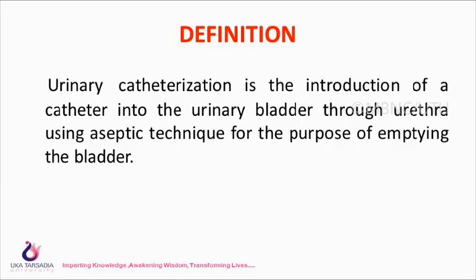Definition: urinary catheterization is the introduction of a catheter into the urinary bladder through the urethra using aseptic technique for the purpose of emptying the bladder.